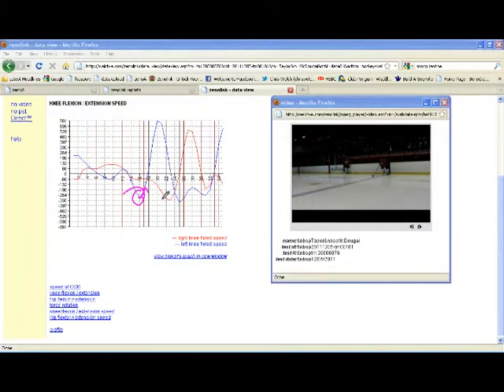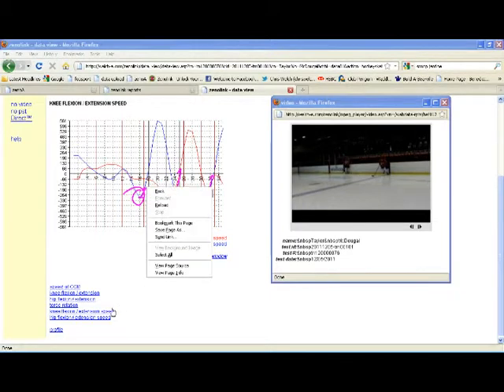Here we see on the right side extension speed of about 330 or so, so not the greatest extension speed, but definitely starting to go into flexion more appropriately, so we're getting some of the pull. And then when we see the left side again, we see only a speed of about 264 with some limited pull forward. So we've got two issues. We've got limited pull or limited flexion just prior to toe off, and we also have limited knee extension. So we're limiting both in terms of pattern as well as output, both on the push extension part as well as the pull, the flexion part, and that's at the knee.